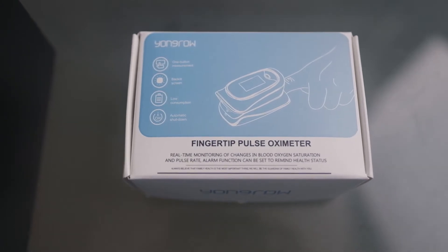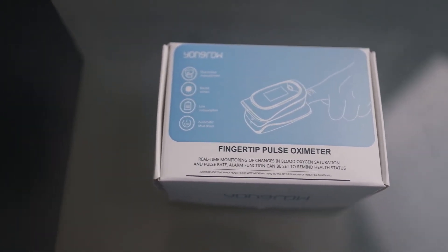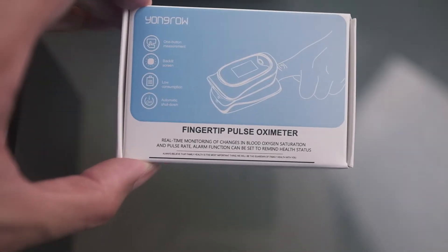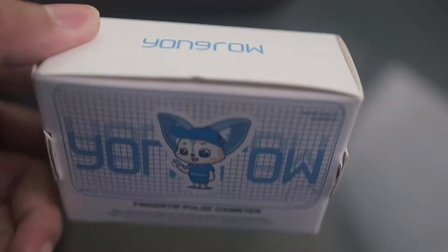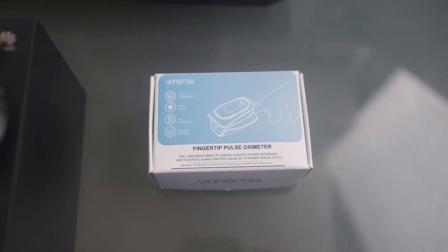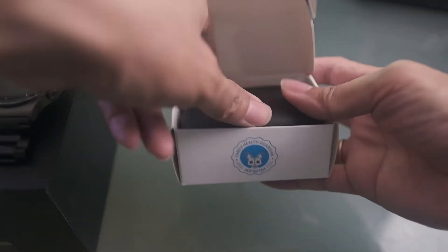What's up everyone. I'll be comparing this fingertip pulse oximeter, which can monitor changes in blood oxygen saturation, with the Huawei Watch GT2 Pro, which can also test blood oxygen level or SpO2. This pulse oximeter is supposedly medical grade, even though it's Chinese-made. Let's see how close the Huawei GT2 Pro compares to a medical grade pulse oximeter.